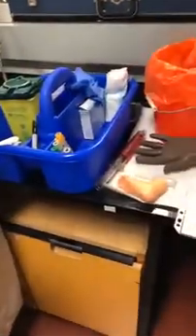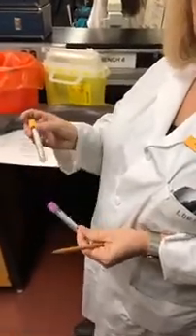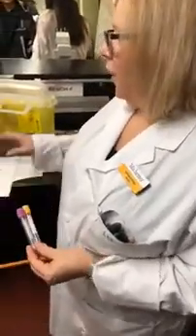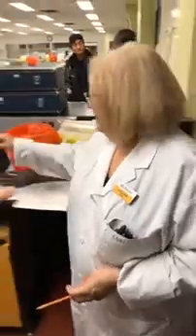We do use all the real tubes — we have different tubes and students have to learn what's in each of them. Different tubes are used for different types of tests: this one would be used for hematology, and this one often for chemistry tests. So the students have to learn what's in those and when to use them appropriately. Then they learn to take blood on the arms, and then they progress to taking blood from each other — so as a student, you're going to take blood, but you're also going to be donating your arm.